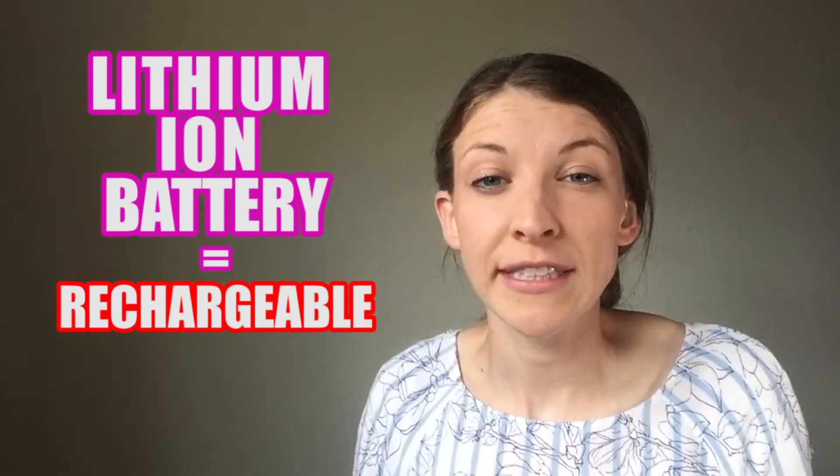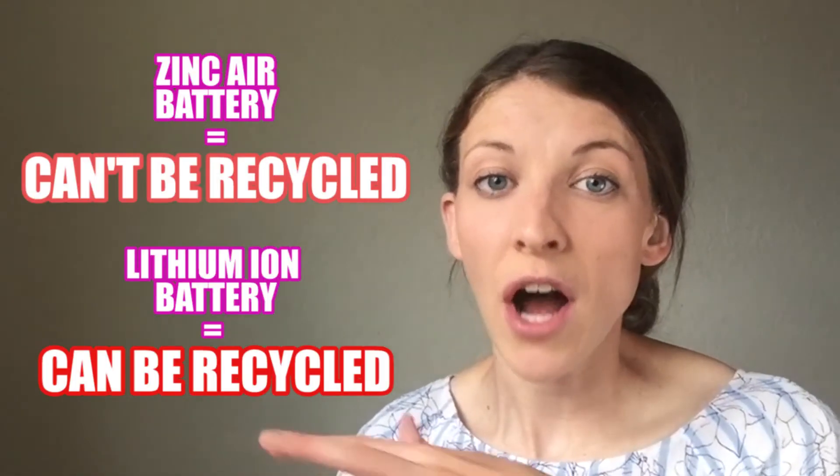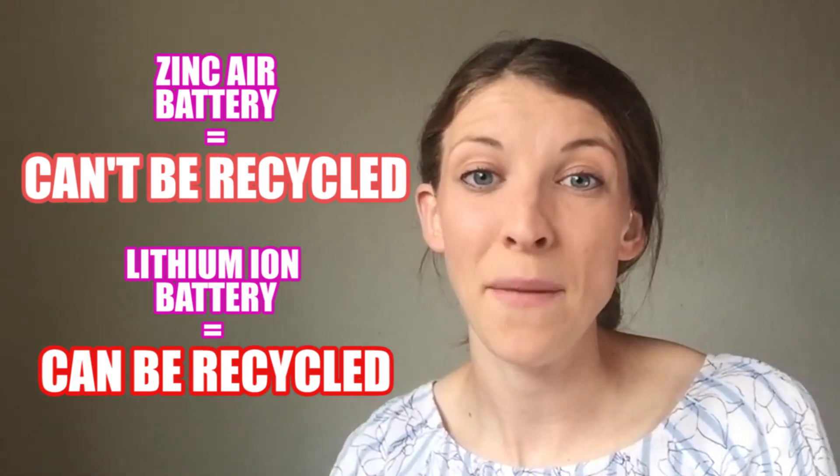Now for the difference between lithium ion batteries and zinc air batteries. Lithium ion batteries are typically rechargeable and have more materials that can be recycled. Zinc air batteries are activated once you pull off the tab, and once the chemical reaction is used up, it can't be recharged or reused — so they're not as eco-friendly and don't recycle well. If you have a choice and want to be eco-conscious, go with lithium ion batteries — but remember, it depends on the type of hearing aid you have and what will power it properly.